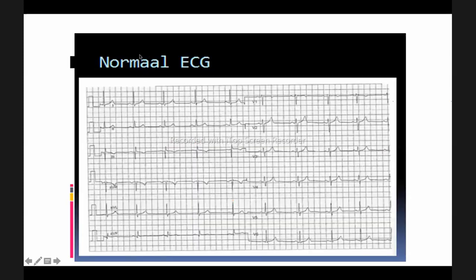So this is in a different language, so it's got a double A there, but just know this is a normal ECG. So remember, it's the standard 12-lead ECG, the recording is for 12 leads. I hope you also had time to practice how to do an ECG when you were doing your physiology. So there are the standard limb leads 1, 2, 3, okay? Then the augmented limb leads: AVR, AVL, AVF. And then these are the precordial or chest leads from V1 all the way to V6.